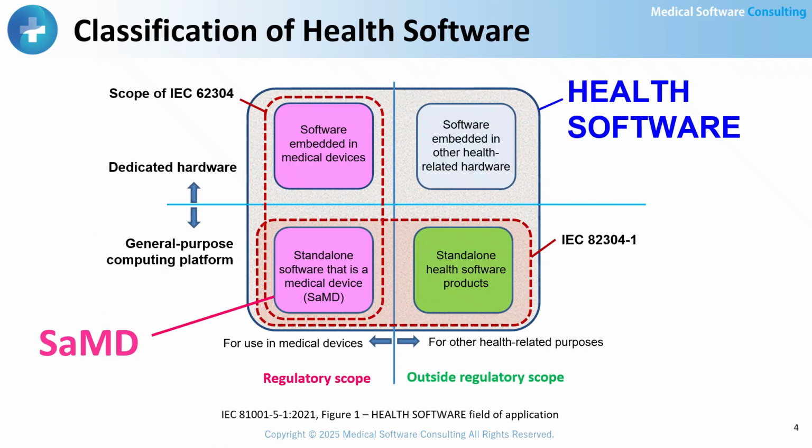Here we see the classification of health software. In the upper left, we have software embedded in a medical device. In the lower left, we have standalone software that is itself a medical device, also known as SAMD. The scope of IEC 62304 applies to these two categories. As shown in this diagram, health software refers to the broader concept of software related to health, which includes regulated medical device software. It is important to note that the term health software does not only refer to non-regulated software.